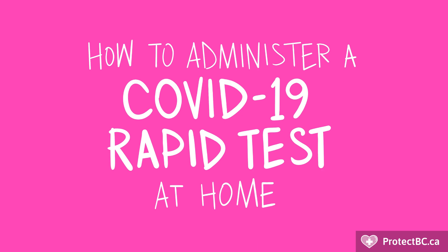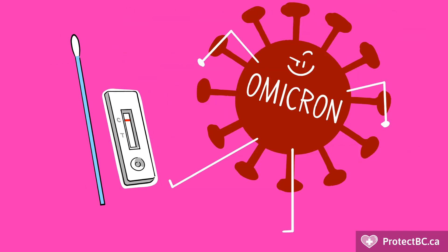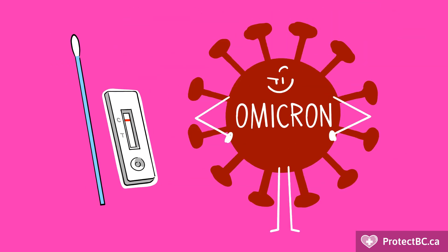How to administer a COVID-19 rapid test at home. These guidelines update the method of sample collection since the arrival of Omicron and all newer sub-variants. Studies suggest combining nasal and oral samples is a better approach for new strains of COVID. The test should otherwise be conducted according to the manufacturer's instructions.